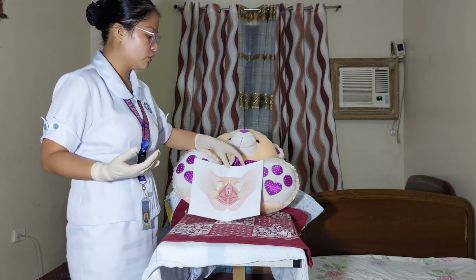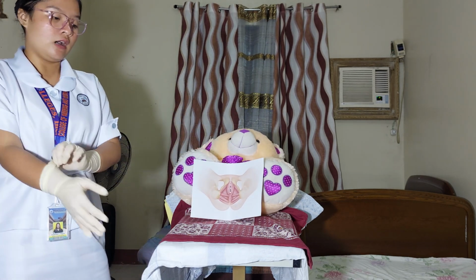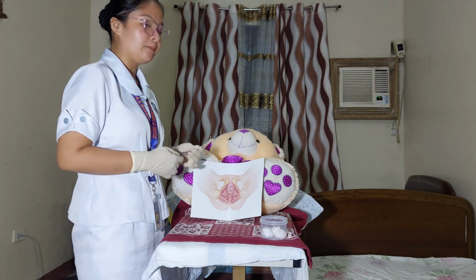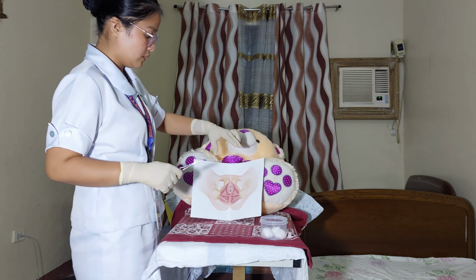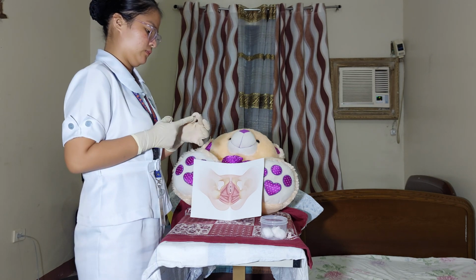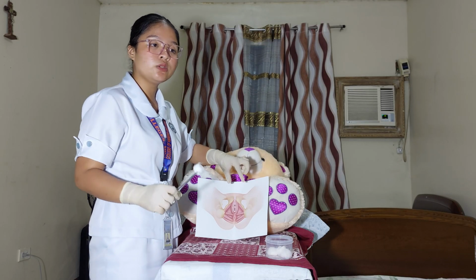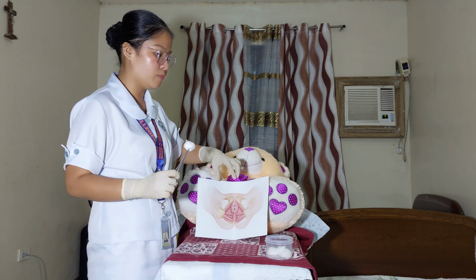So now, I'm going to clean the perineal area of my patient. So, I'm going to do this with antiseptic solution in a cotton ball. With the antiseptic solution in a cotton ball, then I'm going to open the meatus of my patient using my non-dominant hand. So, o-open ko siya gamit yung index and thumb finger ko. So, I'm going to get some cotton balls with antiseptic solution to clean the perineal area of my patient.